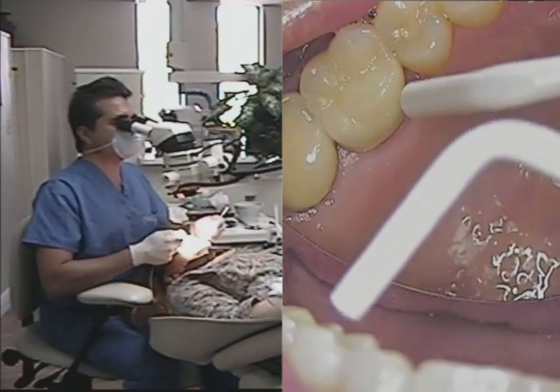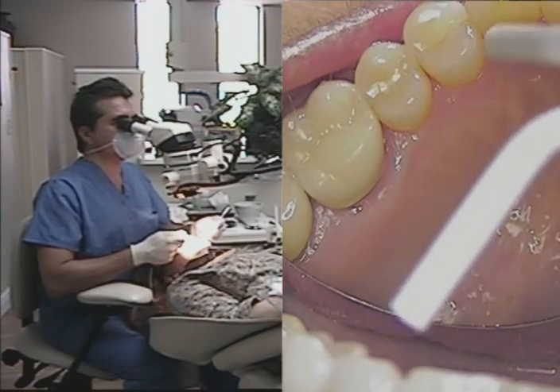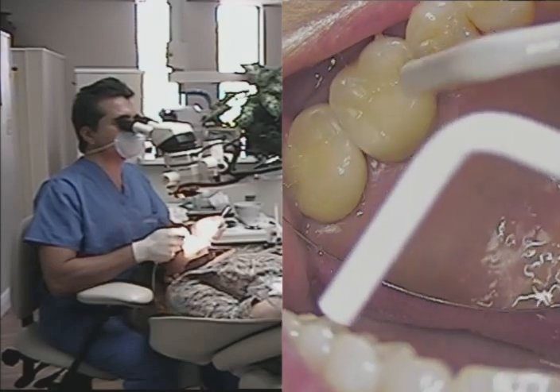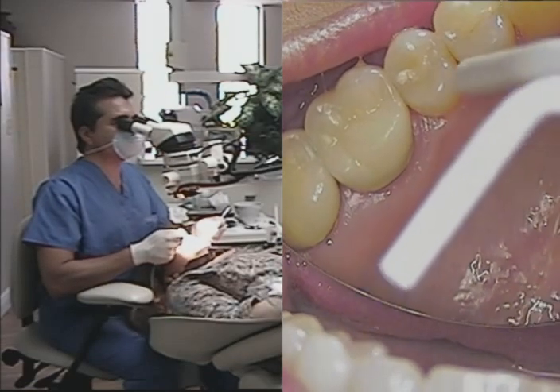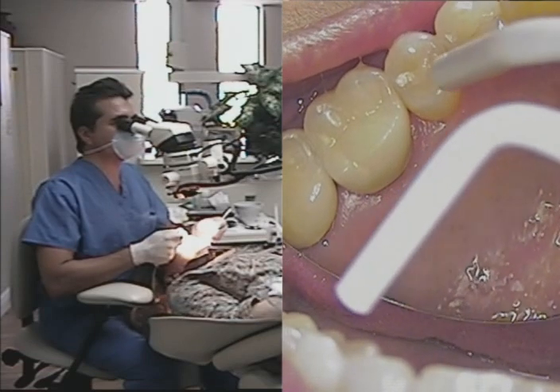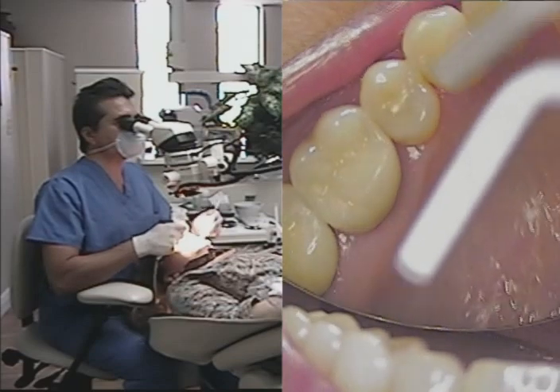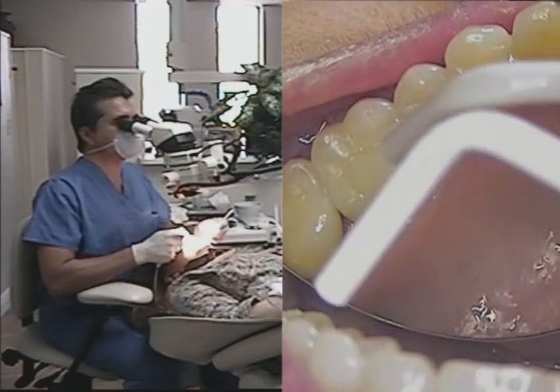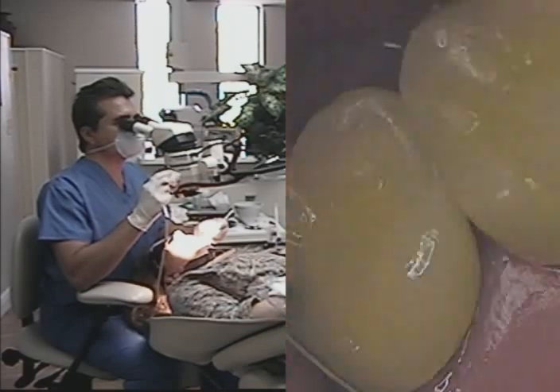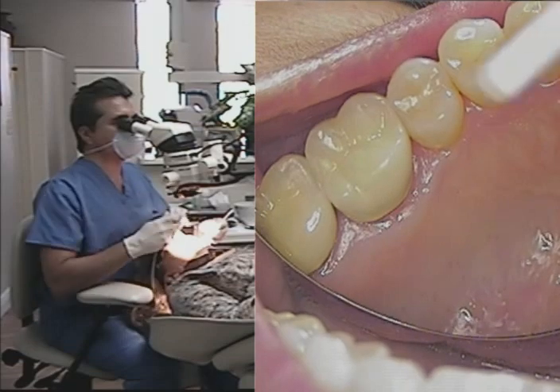It's a very good complement to have them — it actually takes the place of an intraoral camera. In my office I have five microscopes, and we have three microscopes in our in-house laboratory, and they're going to be purchasing their fourth soon. Each one of the microscopes has an onboard video camera, which gives us the ability to record data throughout the entire day.